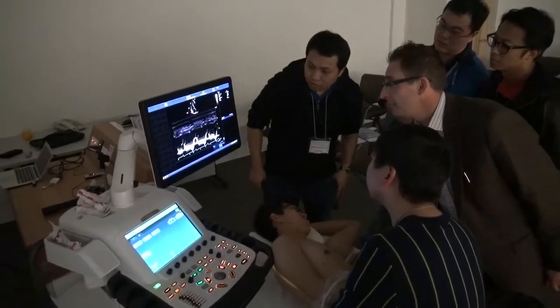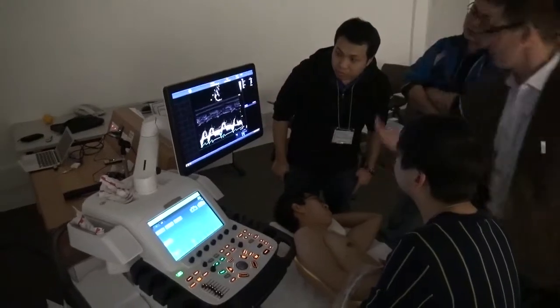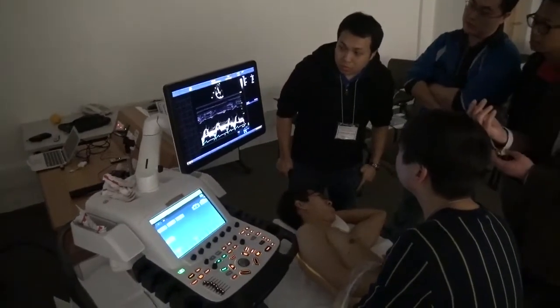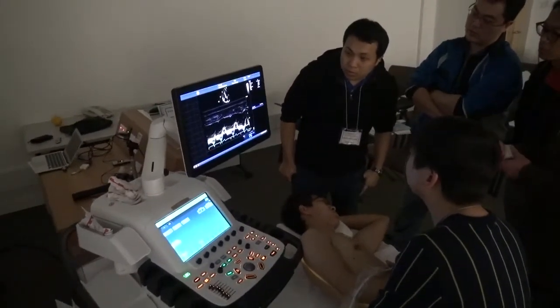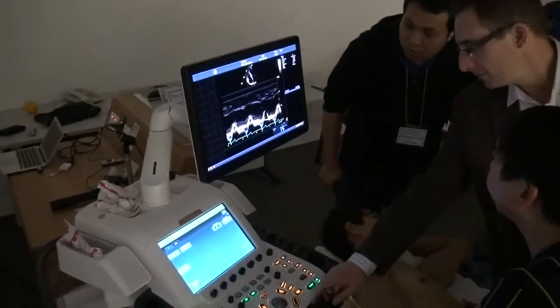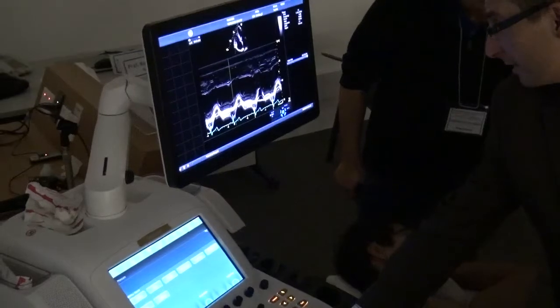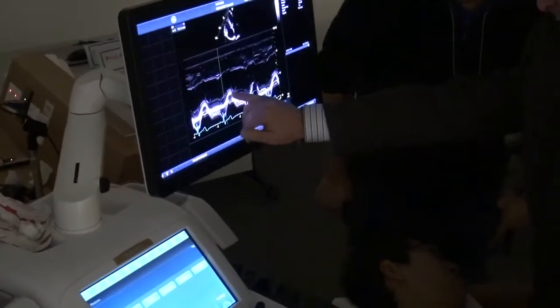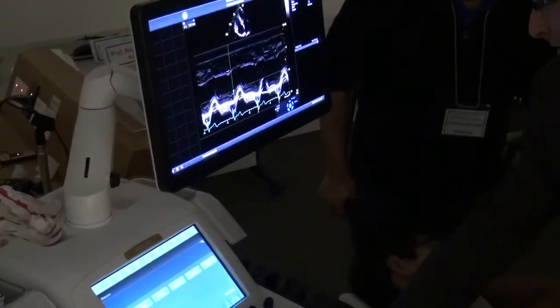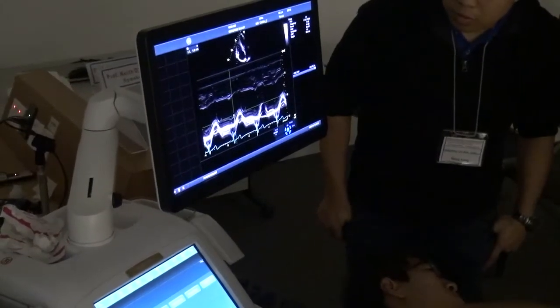It's a movement of the annulus as it moves up. And you see the ventricle, although it squeezes in, it also shortens upwards, and that is a predominant functional aspect for the right side. So if we freeze up there, we can put a caliper on, and we start at the baseline here, we follow the fastest up slope, and we take it to where the brightest bit is, and that's 18, which is absolutely fine.